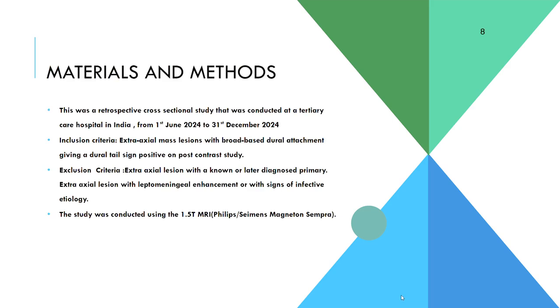The aims and objectives of the study are to segregate the meningiomas into typical and atypical types on MRI brain studies, to assess the common locations of intracranial and juxtacranial meningiomas, and to study the variants of meningiomas and atypical meningiomas. A total of 26 cases were evaluated based on the inclusion criteria. A female predominance was noted in the occurrence of meningioma, mainly in the third decade of life.